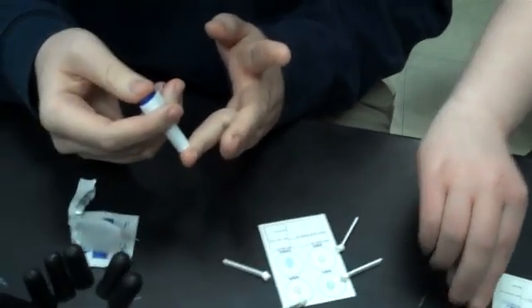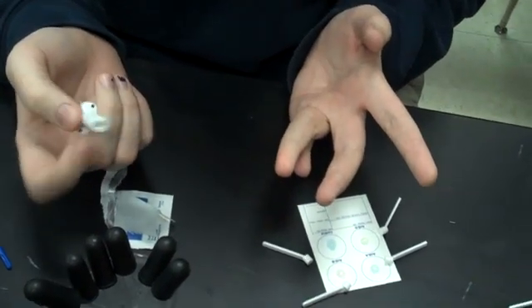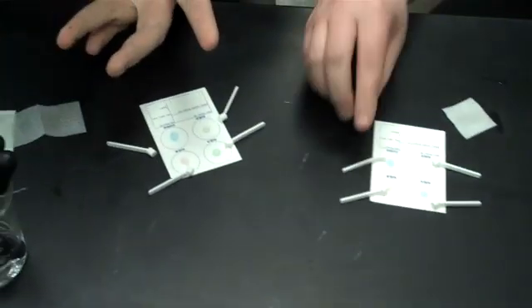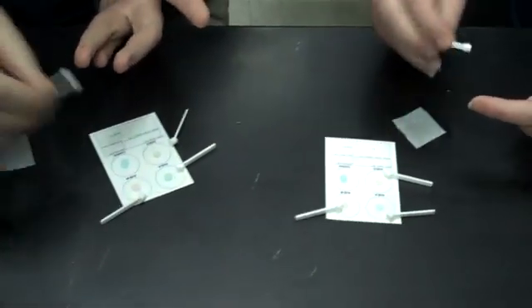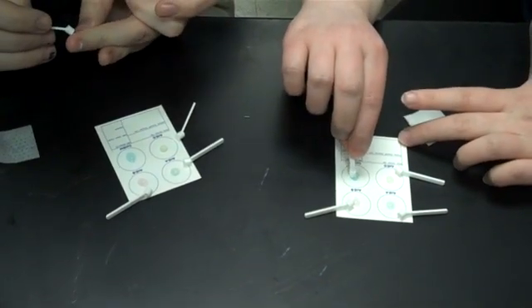Amber, you want to try to do yours? Okay, there you go. Use your other finger to kind of squeeze it out. Now use the little sticks to transfer the blood onto your card.